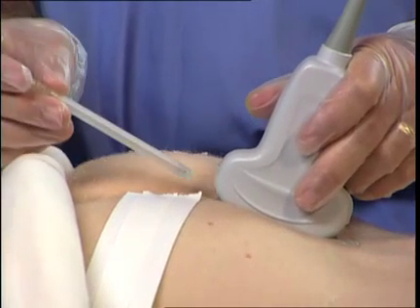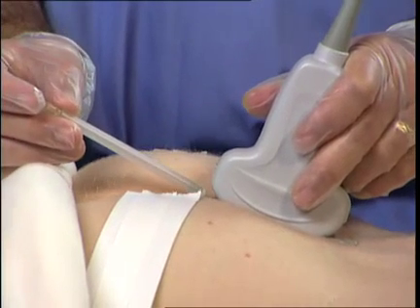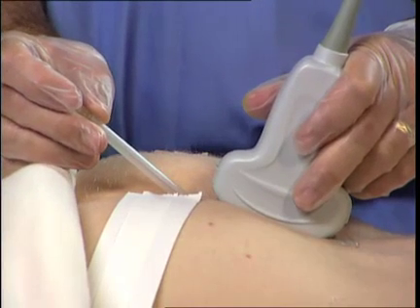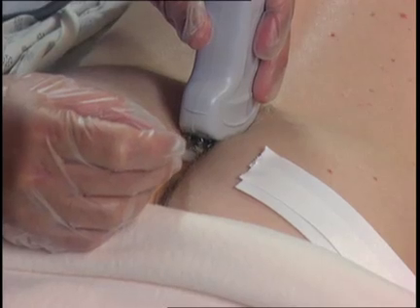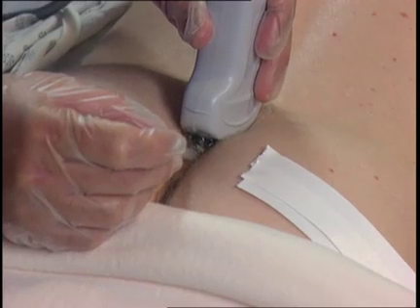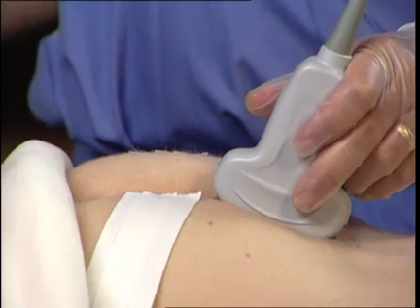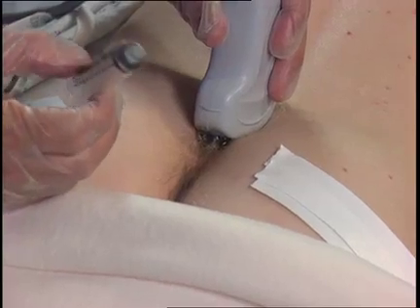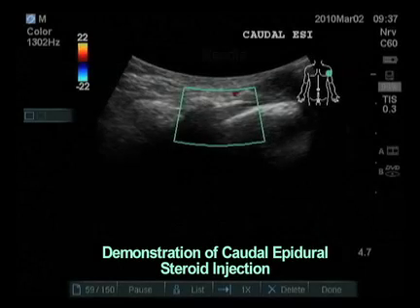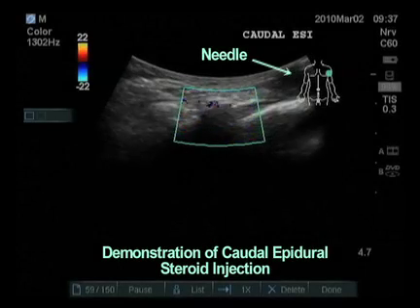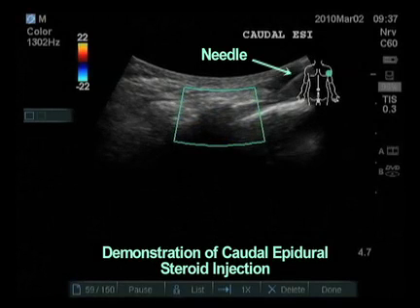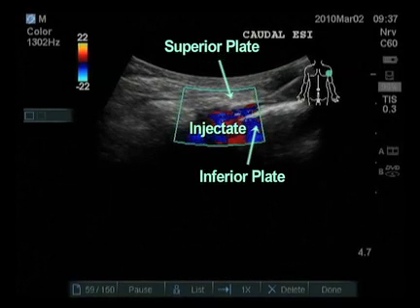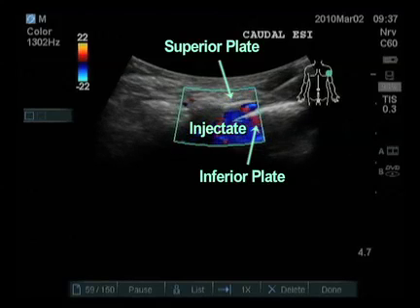I would then place the 3.5-inch 25-gauge spinal needle along the same anesthetized track, and once between the two plates, I would attach my local anesthetic and steroid mix. The needle is visible as this view is in the long axis. The sacral plate is clearly visible, diving anterior and cephalad.